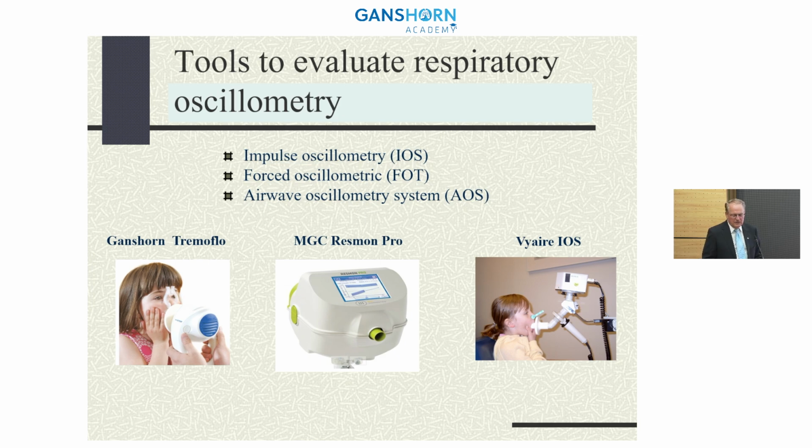We have impulse oscillometers, which use a speaker. We have airwave oscillometry, which uses a membrane to create the airwave oscillometries that take place.